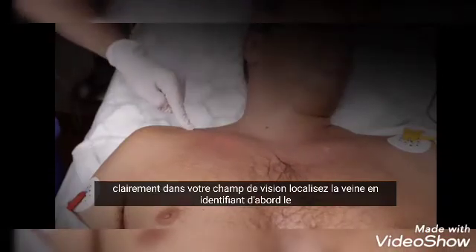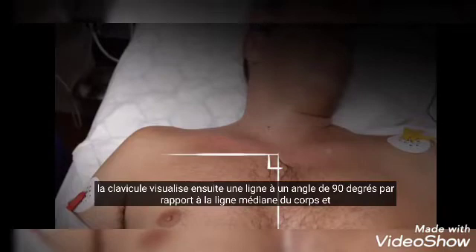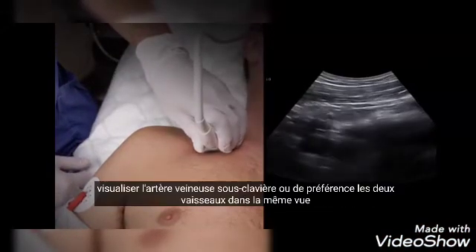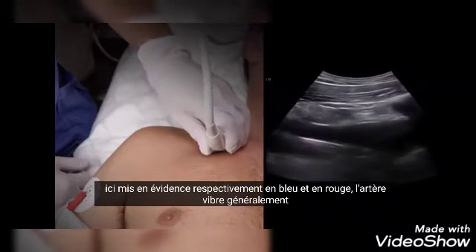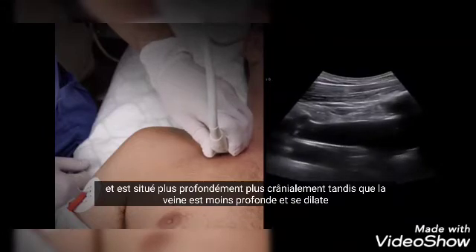Locate the vein by first identifying the clavicle, then visualize a line at a 90 degree angle from the body's midline and align the probe with it. Then tilt cranially in order to visualize the subclavian vein, artery, or preferably both vessels in the same view, highlighted in blue and red respectively.